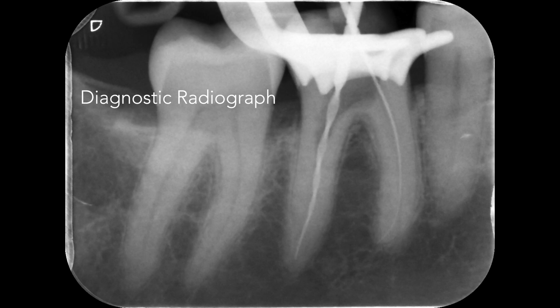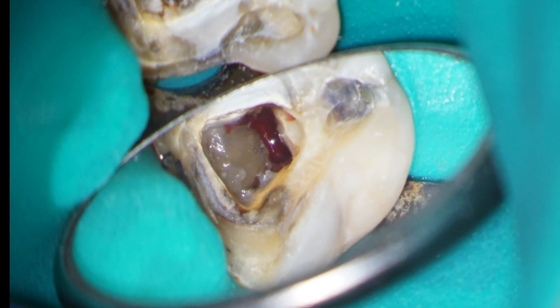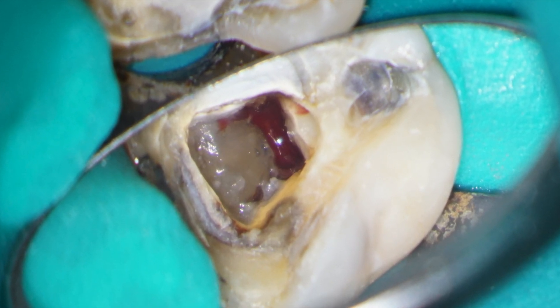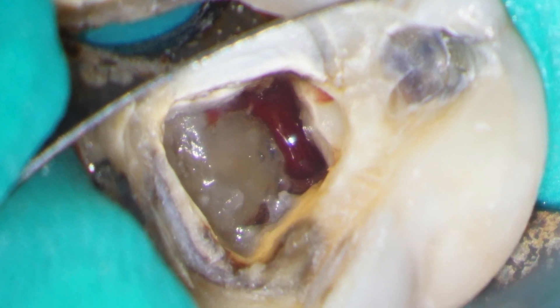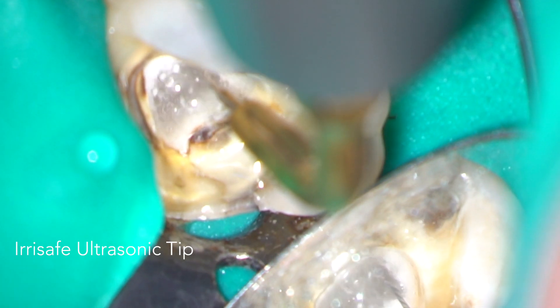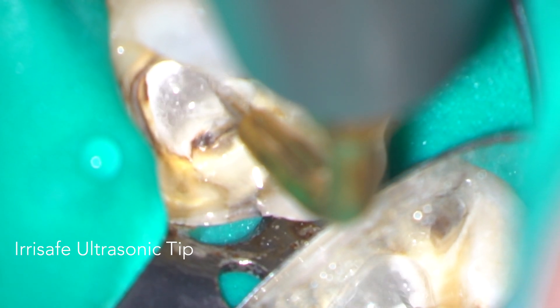A diagnostic working length radiograph was exposed to confirm the working lengths. Preparation was completed with a primary reciprocating instrument — this has a size 25 tip and a variable taper. The distal canal is bleeding quite heavily, and this is something that you'll commonly find with internal resorption cases where the tooth is still vital. Inflamed and bleeding pulp tissue was removed using 3% sodium hypochlorite agitated with an Irrisafe ultrasonic tip.